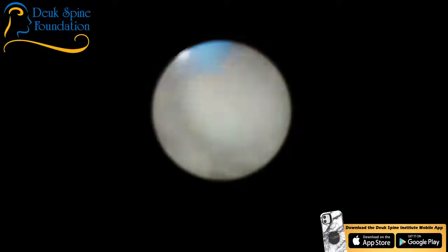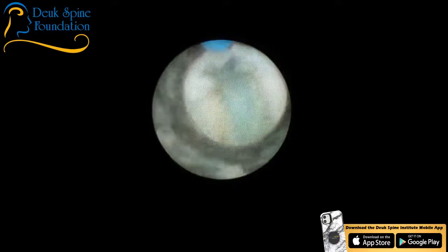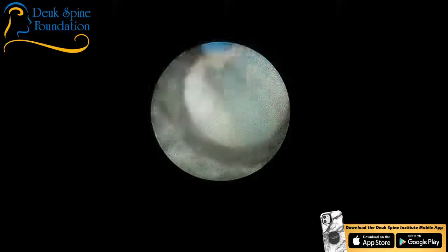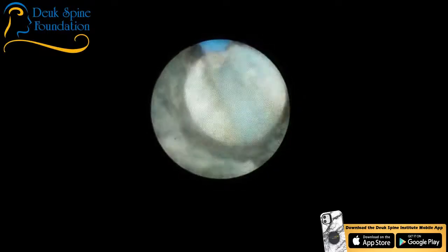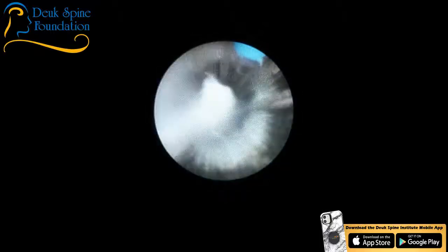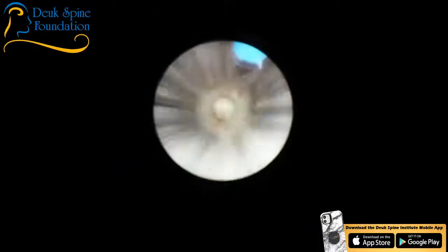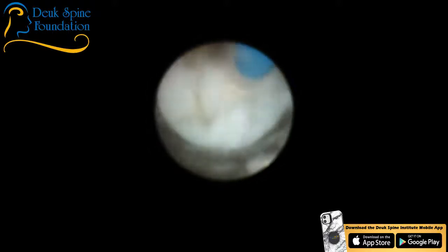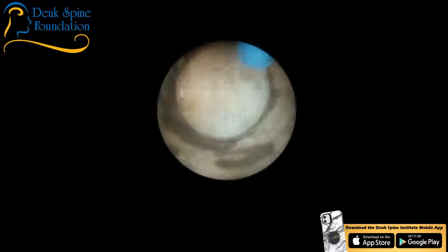Very common. Two-thirds of the patients in our study with the Deuk laser disc repairs that we did on the cervical spine had headaches. We call those headaches, when they're coming from a herniated or degenerated disc, cervicogenic. Cervicogenic headaches just means the headache is coming from the cervical region, which is your neck. And specifically, it comes from the herniation, the annular tear, really. You all saw that last case where we got rid of all the herniations, and her headaches are now 100% gone.